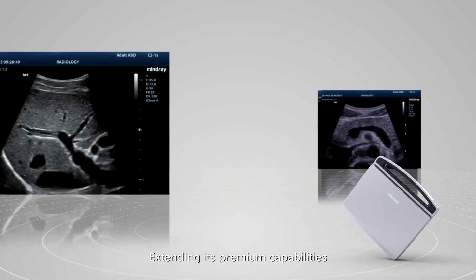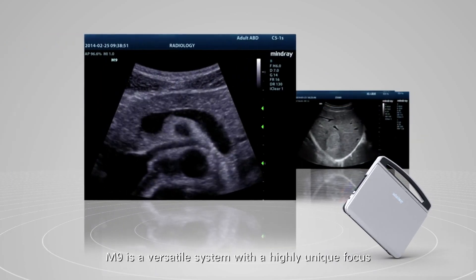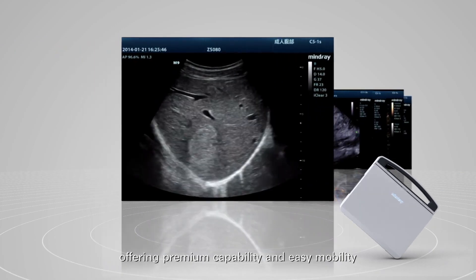Extending its premium capabilities to the most demanding applications, M9 is a versatile system with a highly unique focus, offering premium capability and easy mobility.